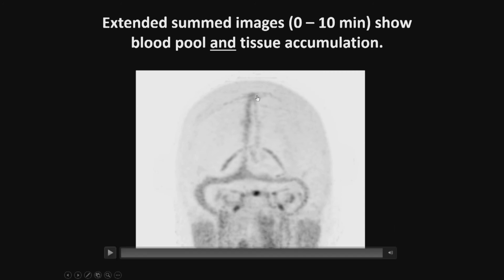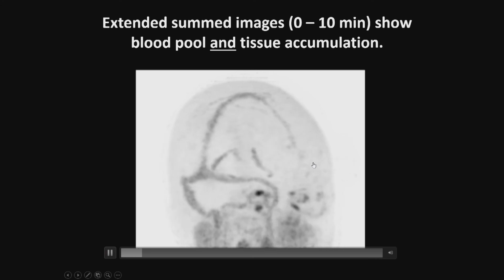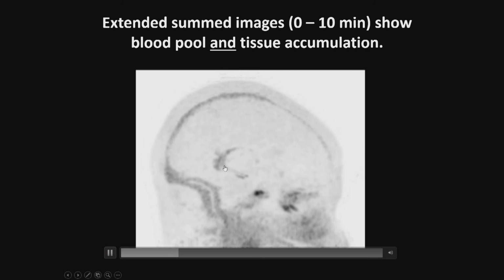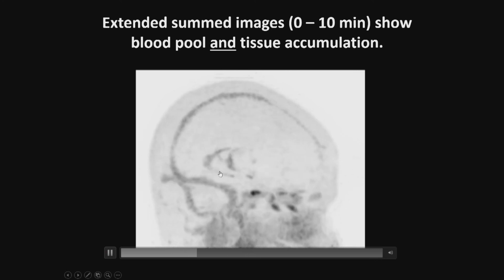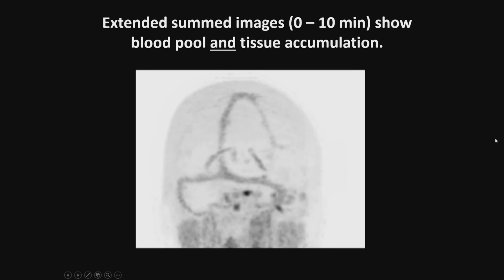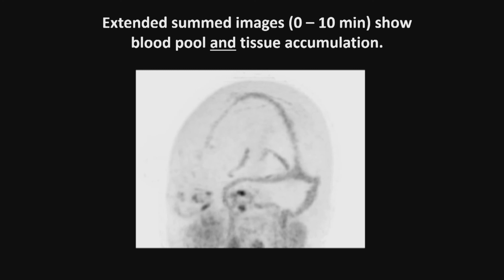I've seen the ventricle maybe a little bit. So here's an image of it. You can see the venous drainage, the venous sinus, but here now, three-dimensionally, you can see better this choroid plexus, which is the tissue that makes the CSF for the brain, the water in the brain.